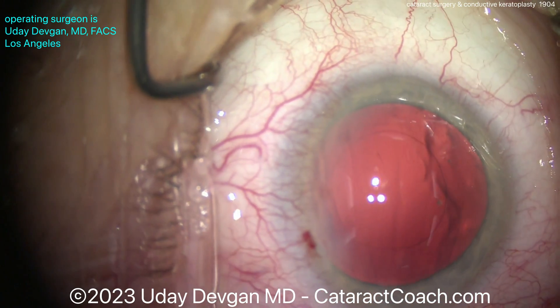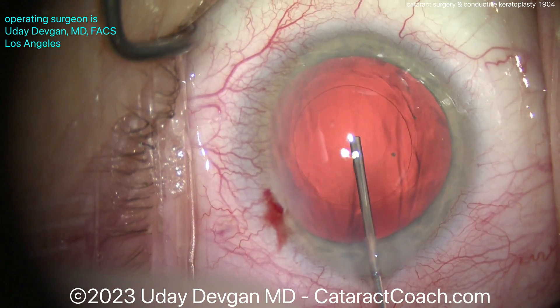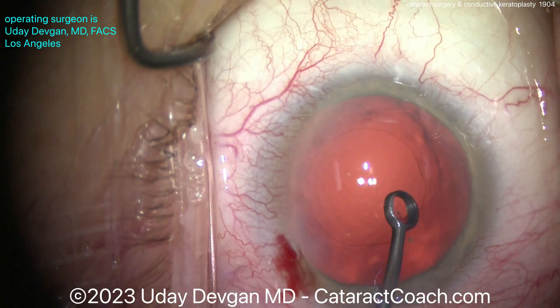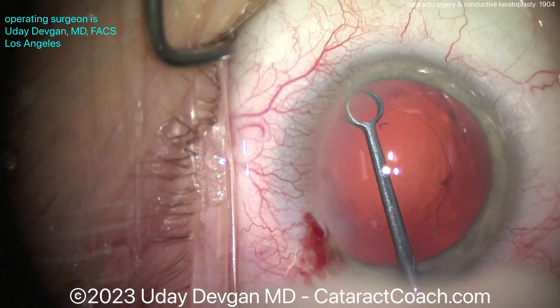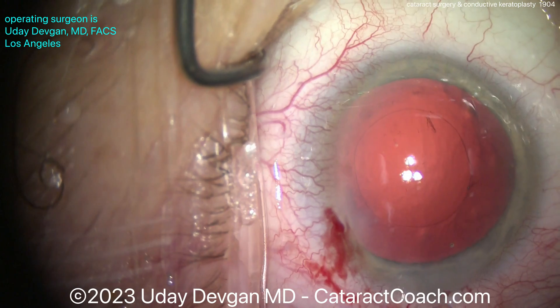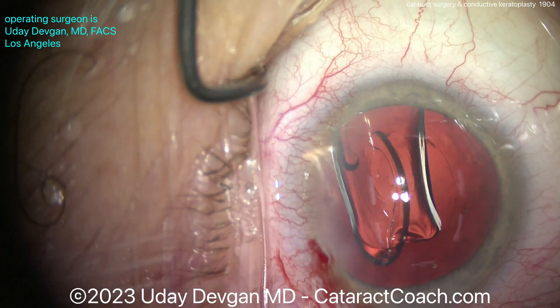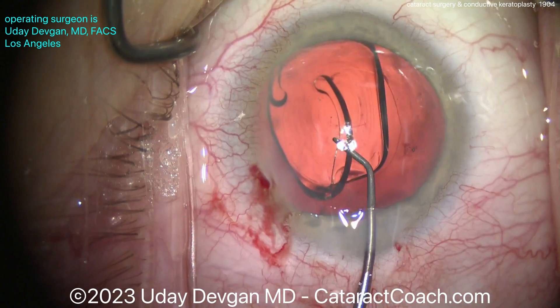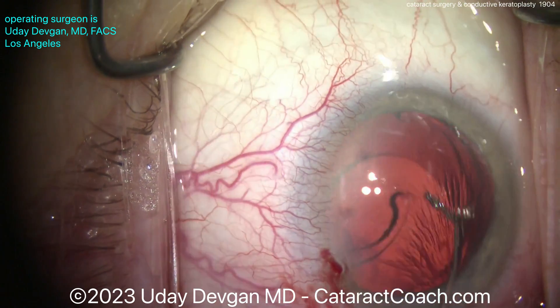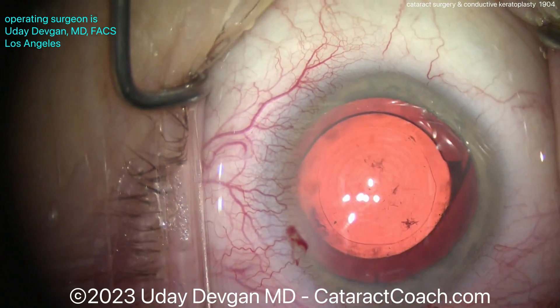We put a trifocal lens in this patient — obviously that's what the patient wanted. Instead of aiming for a perfect plano result, we aimed just a little bit hyperopic: about plus 0.25, maybe even plus 0.3 to 0.4. That allows the patient to have an outcome very close to emmetropia. I aimed plus a quarter here and the patient ended up just about perfect plano and was very happy with the trifocal lens. The other untouched eye was very easy — just standard calculations. You're measuring the true corneal power, so that slight hyperopic target is enough of a shift.